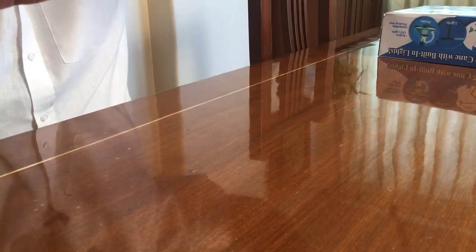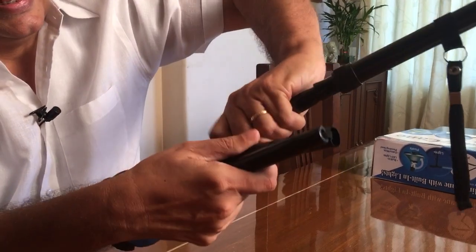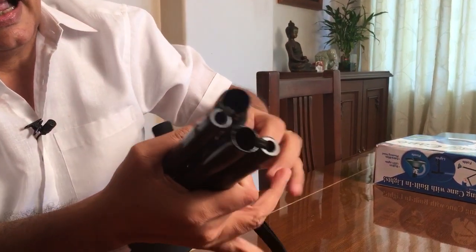When you don't need it, all you do is raise this up, fold it around once again, and store it away.